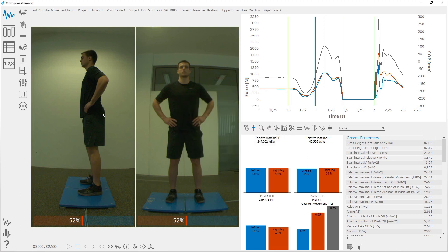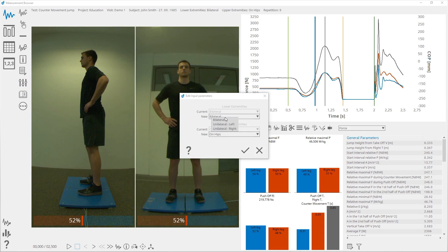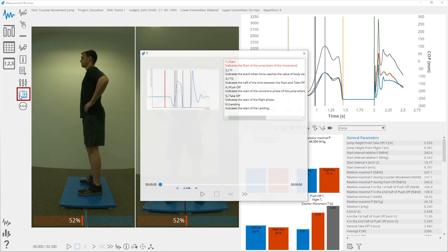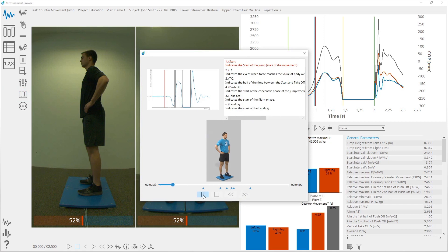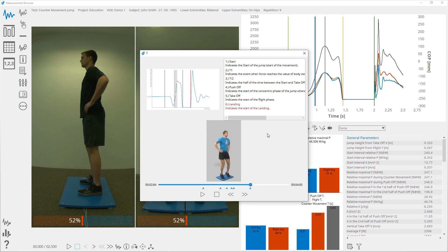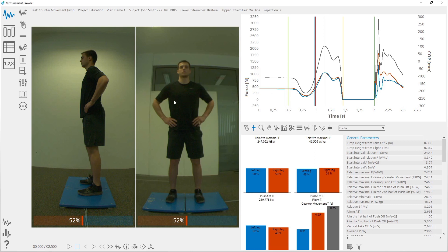To edit the input parameters for the selected measurement, select Edit Input Parameters, set new input parameters, and confirm. The selected measurement is now saved with the newly selected input parameters. Clicking on the After Test Instructions button will open a new window where instructions describing different phases of the test, marked by cursors on the graph, are shown. Clicking on the More button will open the test-specific visualizations. The indirect parameters table is accessible via this button.